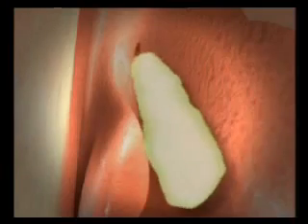Under direct endoscopic visualization, the initial osteotomy is expanded by transcanalicular route in the antero-inferior direction by juxtaposition of converging bursts in the form of a circle. Another option is to expand the initial osteotomy by the endonasal route.